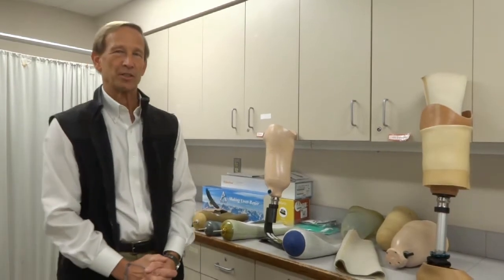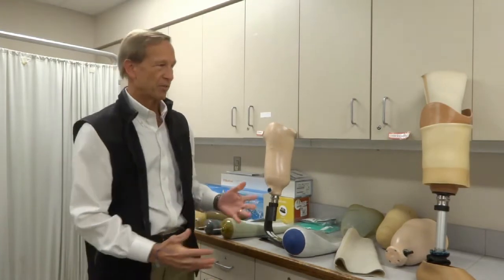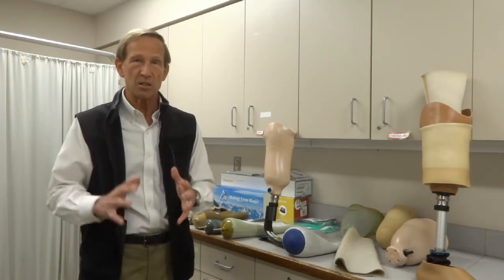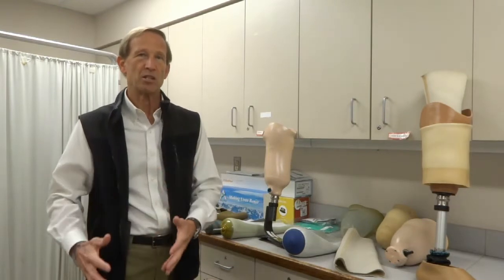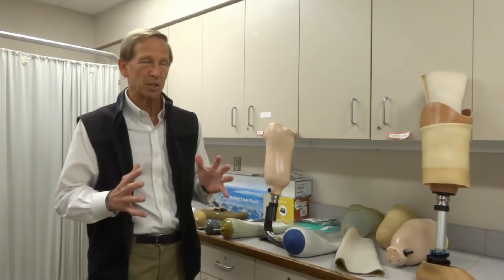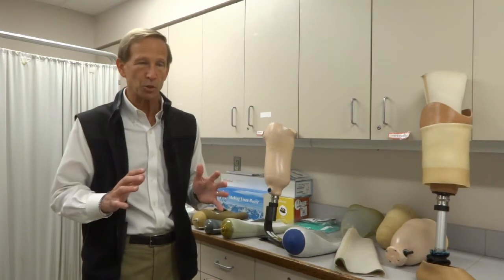Welcome back. It's Dr. Ustall here again. In this segment, we're going to talk about below-the-knee prosthetics and specifically about the socket — the part of the prosthesis that goes onto your leg, the part that's custom-made that acts as the connection of your body to the prosthetic foot and eventually to the ground. There are several different parts and several steps along the way, so I'm going to explain each one as we go and some of the problems that you can have with each one.